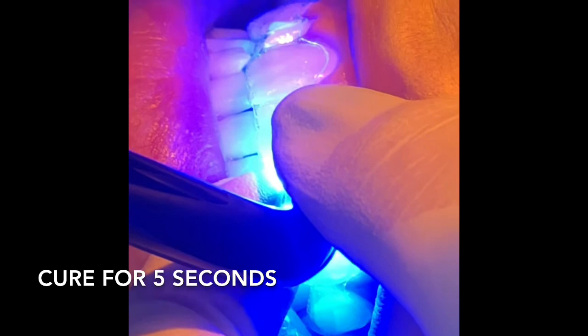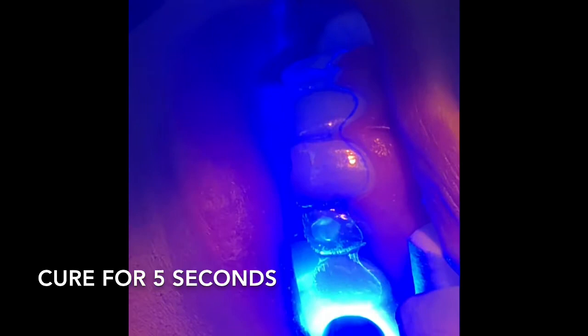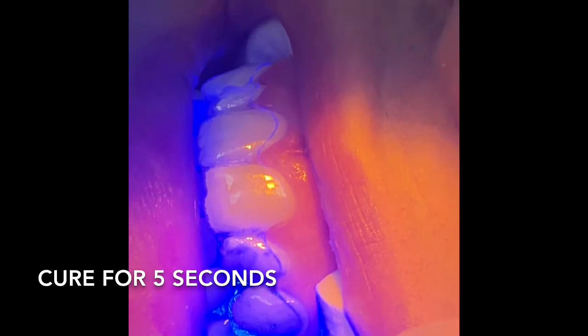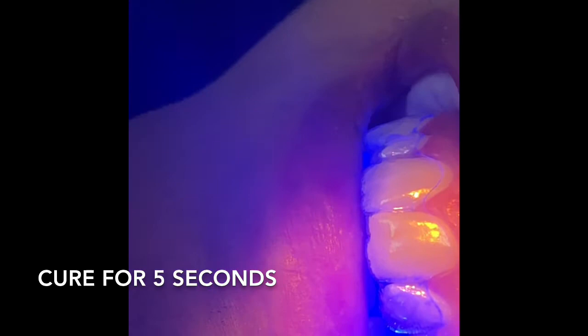We got to do the big reveal - they're not all on and we can't use this arch. Actually, I forgot to cure the bond - I'm used to not having to cure it that way. She usually does the two-step method. I'm trying to simplify this for the newer assistants out there.